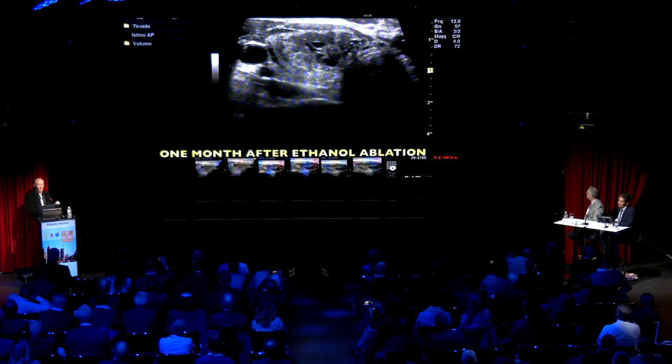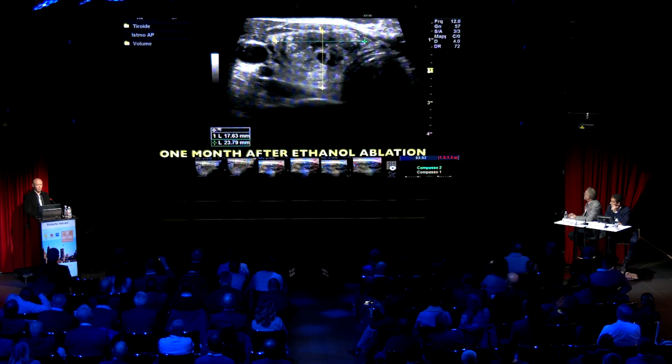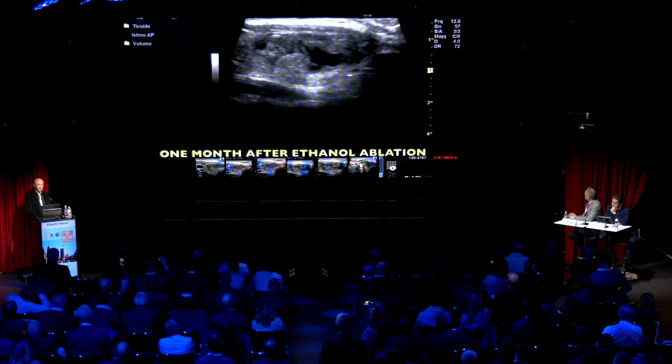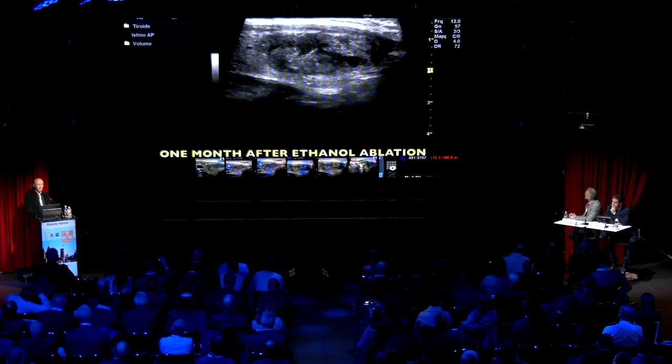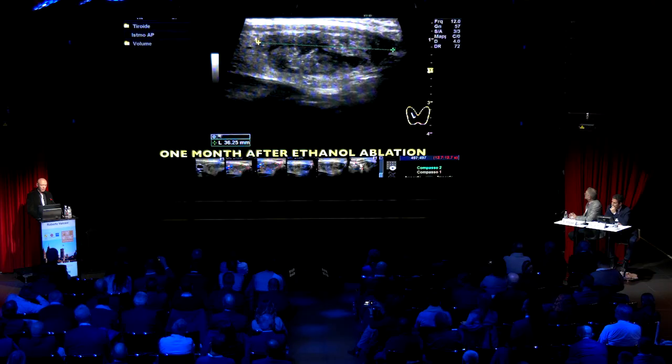The vast majority of the cyst was ablated, and it was transformed into scarring tissue, which is the darkest part. Yet some thyroid parenchyma tissue was not destroyed, and here you see some parenchyma tissue which was not destroyed, and some fluid remained inside. The volume reduction was good, but it was not satisfying enough for me. And I show you other techniques that could be used.